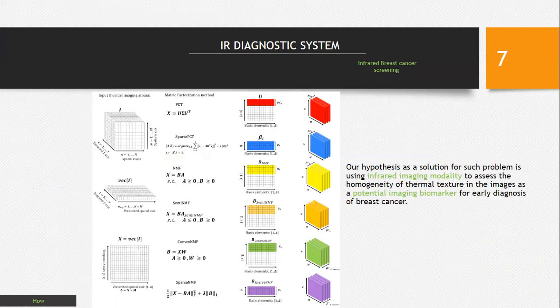Ultimately, each of these methods has a similar framework for minimizing the pairwise distance to compress the data, although different mathematical criteria drive each of the calculations. These methods are great preliminary steps in identifying thermal biomarkers associated with breast cancer.